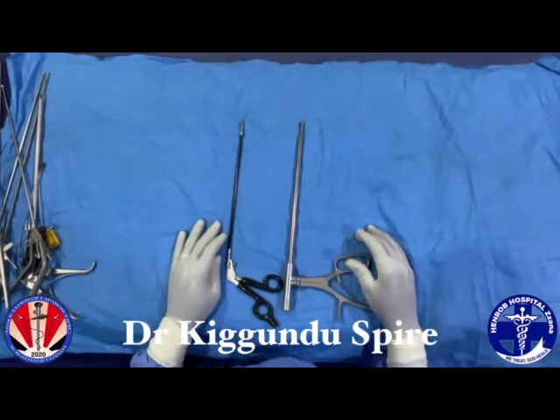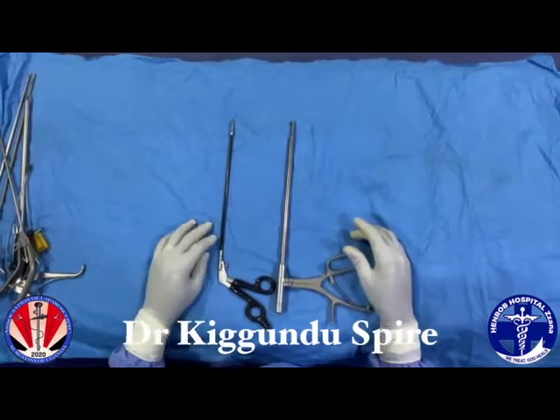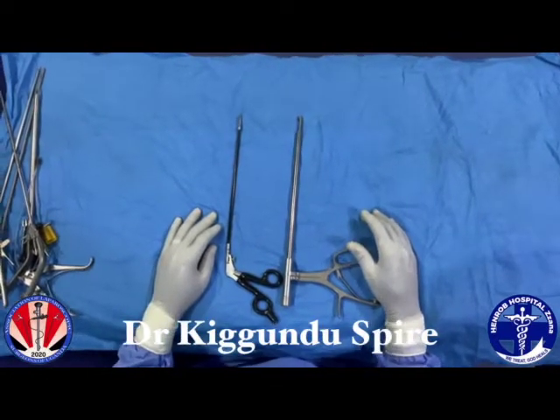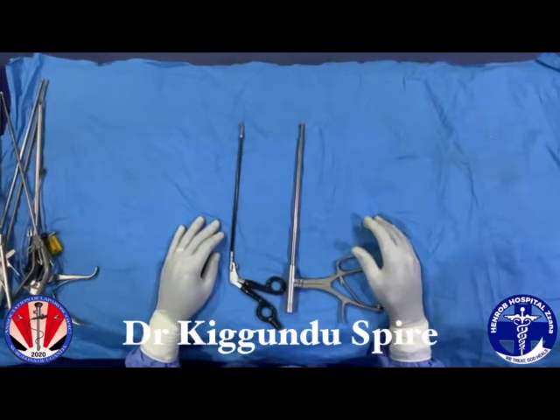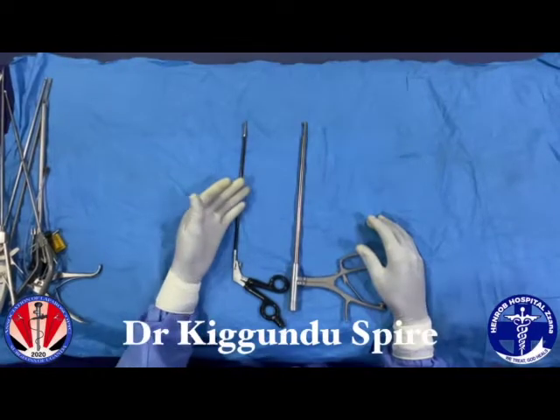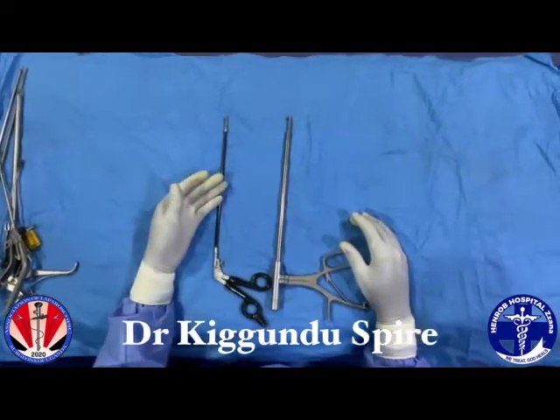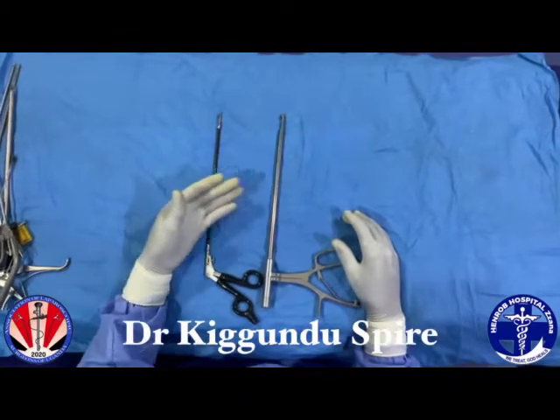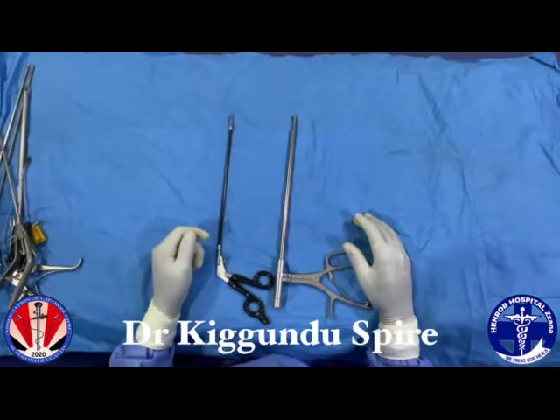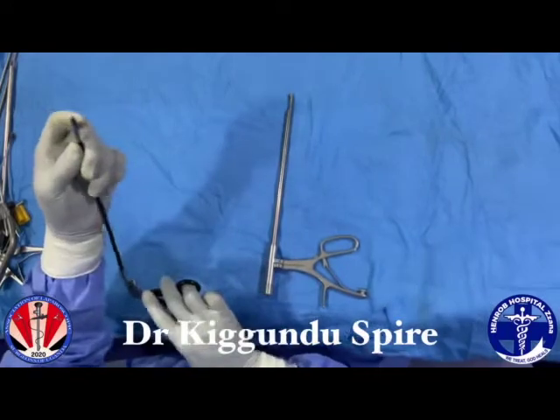There are times during laparoscopy where you just want to take a biopsy for histology analysis, and there are two instruments here that come in handy — these are called the biopsy forceps. Biopsy forceps can be insulated or non-insulated, and they can come in small sizes, as small as five millimeters, or 10 and 12 millimeters. This instrument can take a punch on the tissue.